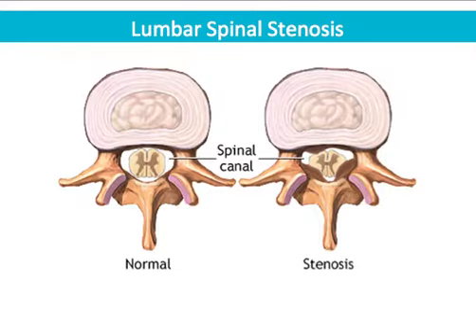And so one of the things we want to do is you're going to be injecting right through this area, right around the facet joint, fanning this entire area. And then the stem cells will be able to mobilize themselves into this inflammatory area that's releasing lots of cytokines, communicating with your body. There's a big problem because that's a big nerve, and so the stem cells will be drawn into that area just like a magnet.